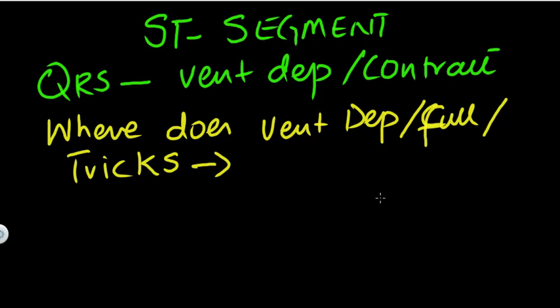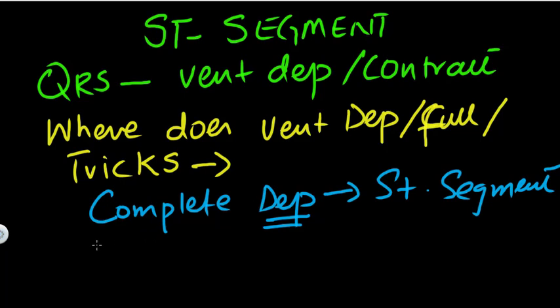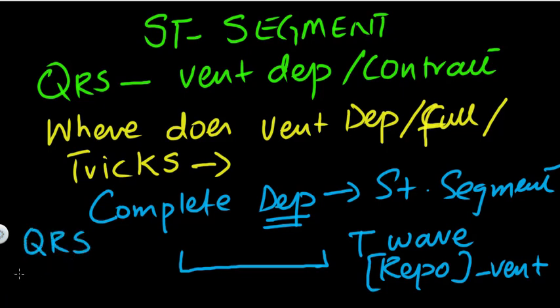So notice the word, I'm repeating this word, complete depolarization, I'm just going to write DEP, would take place in your ST segment, because this is the segment before your T wave, which is basically your repolarization of ventricles, and your QRS complex, which is your ventricular depolarization.